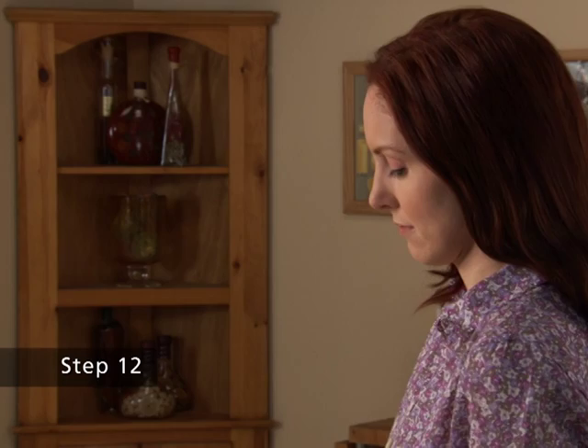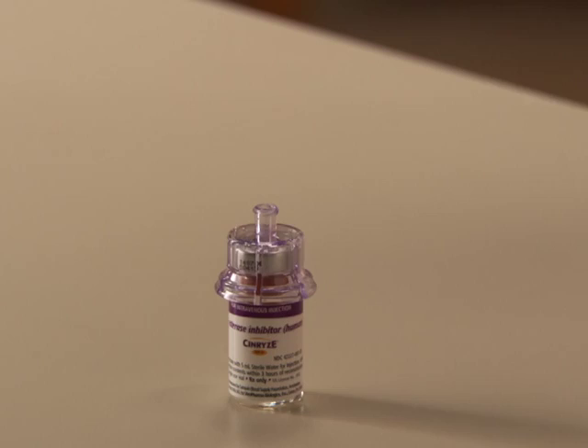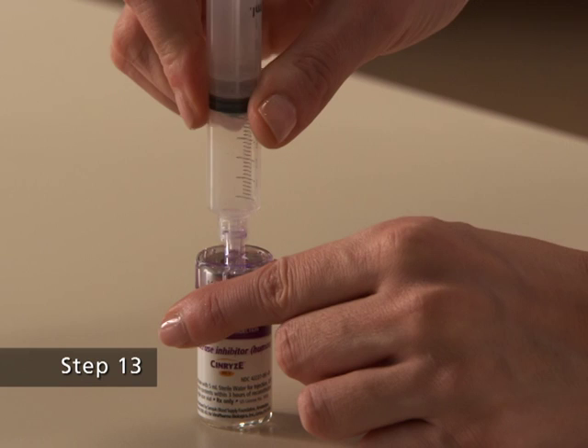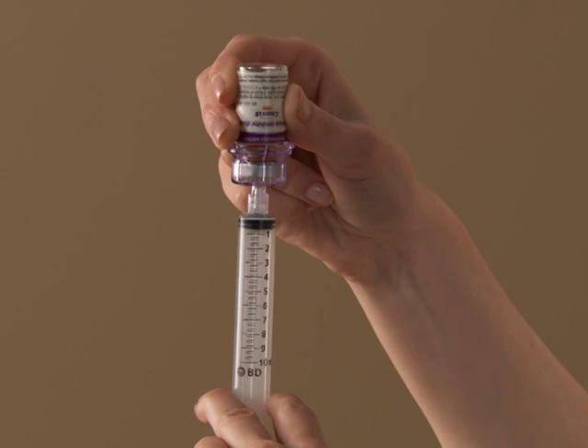Step 12. Utilizing a sterile, disposable, 10 mL syringe, draw back the plunger to allow approximately 5 mL of air into the syringe. Step 13. Attach the syringe onto the clear end of the Mix 2 vial transfer device by turning it clockwise. Step 14. Turn the vial of Synrise upside down and inject the air into the vial.